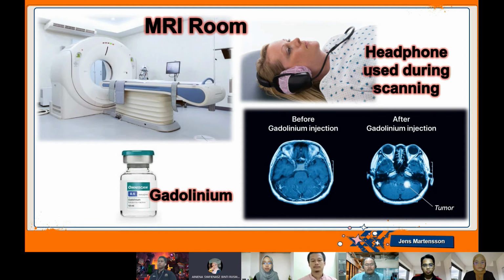Most MRI exams take between 15 to 45 minutes to complete, depending on the body part imaged and how many images are needed, although some exams may take about 1 hour or longer. You will be told ahead of time how long your scan is expected to take. You will be asked to remain perfectly still during the time the imaging takes place, but between sequences, some minor movement may be allowed. The MRI technologist will advise you accordingly.